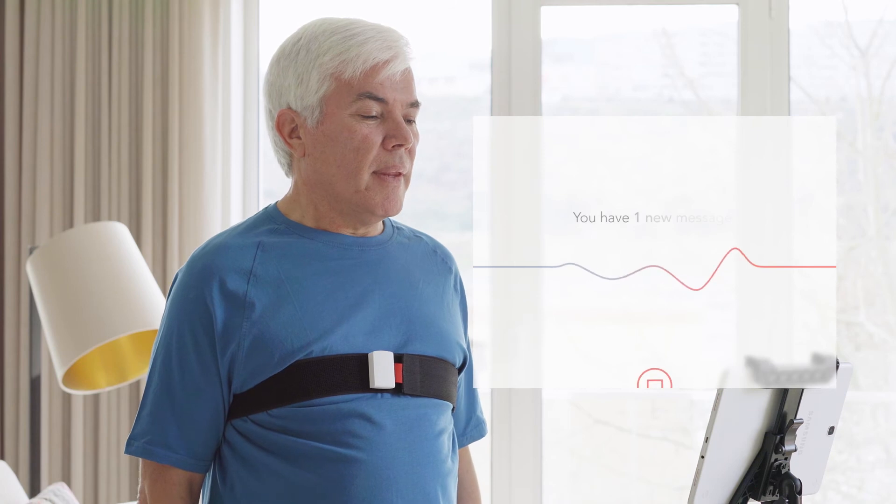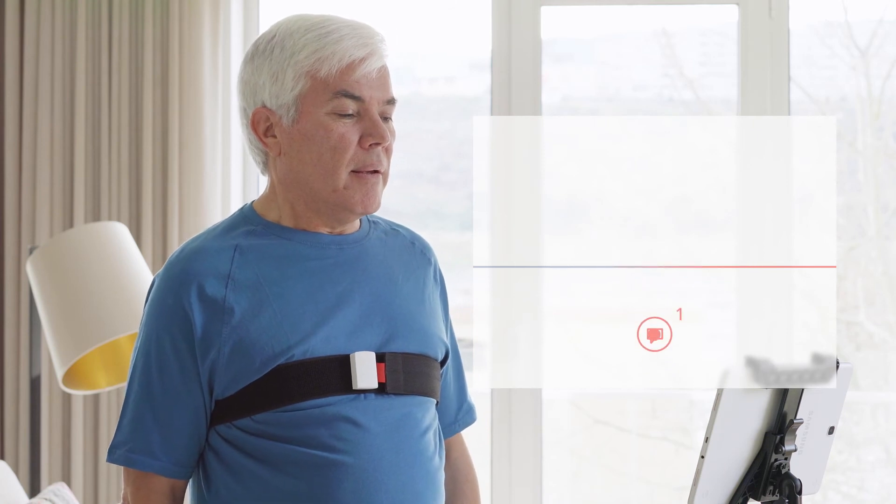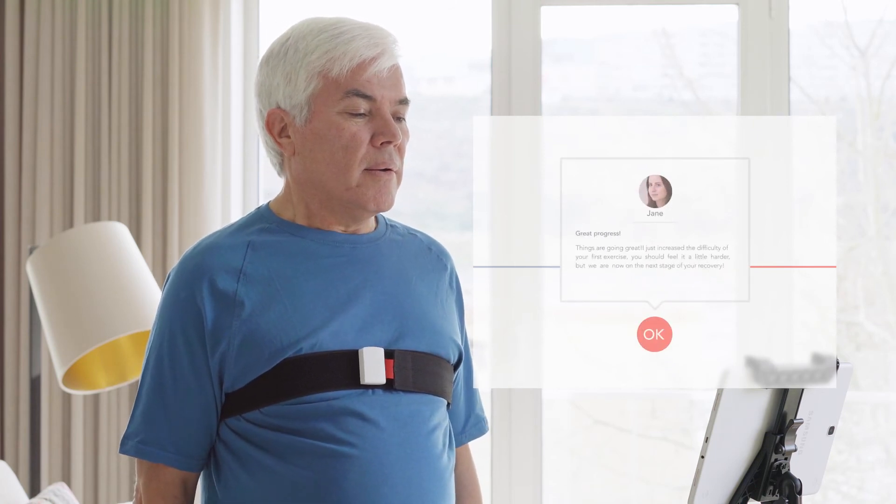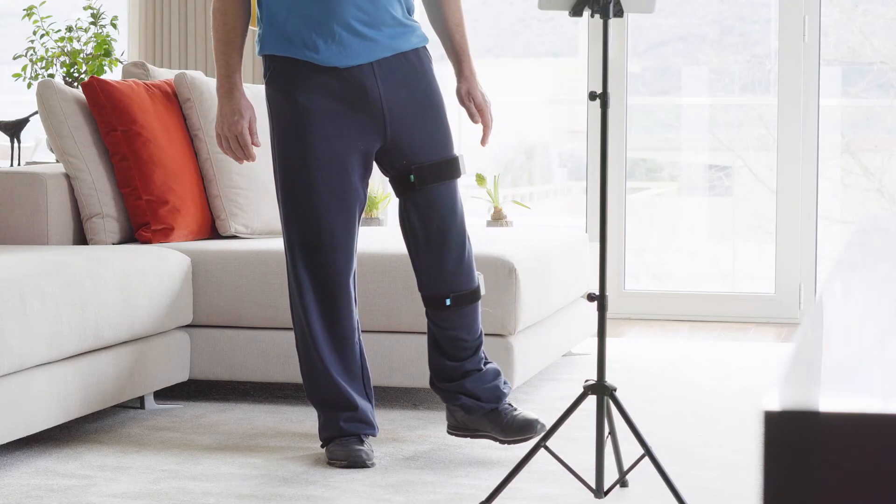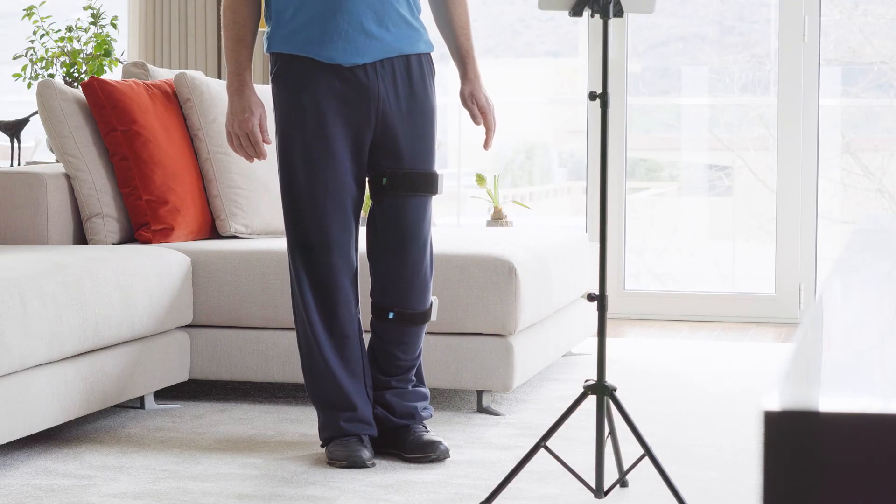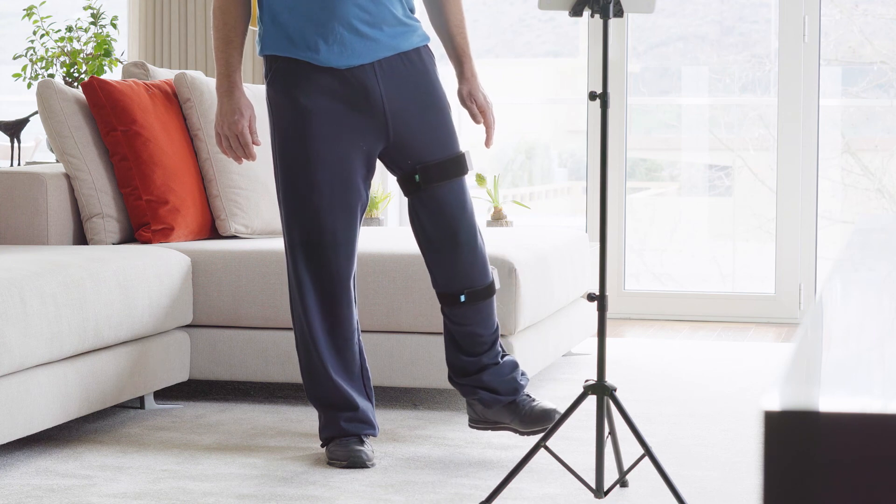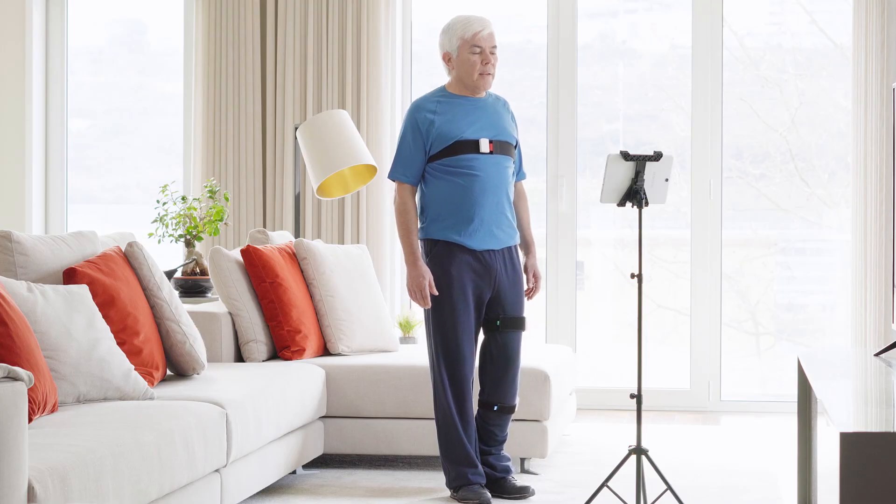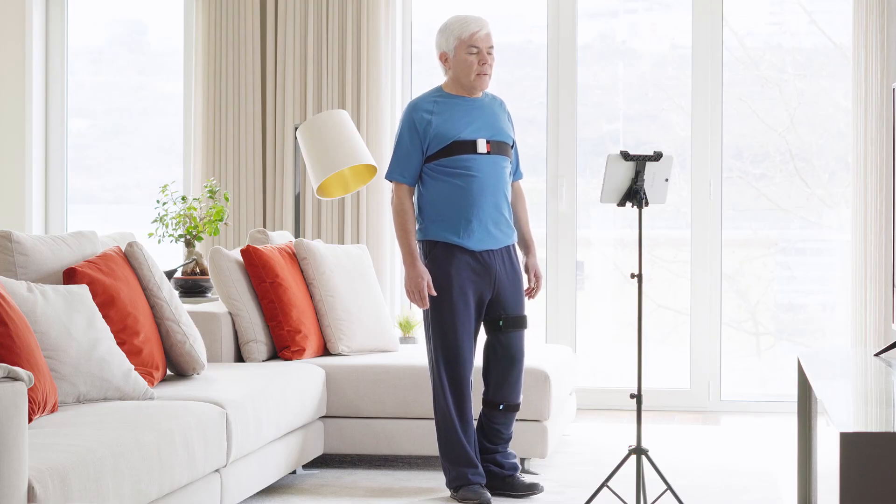You have one new message. SwordPhoenix is already making a difference in the daily lives of people around the world, allowing them to perform intensive, evidence-based rehabilitation in the comfort of their own home.